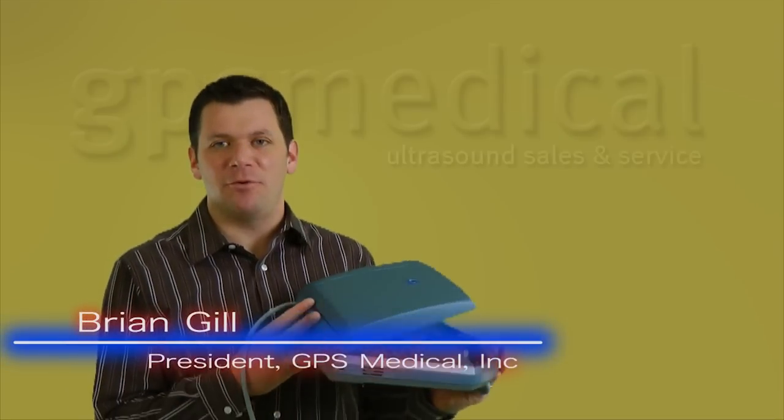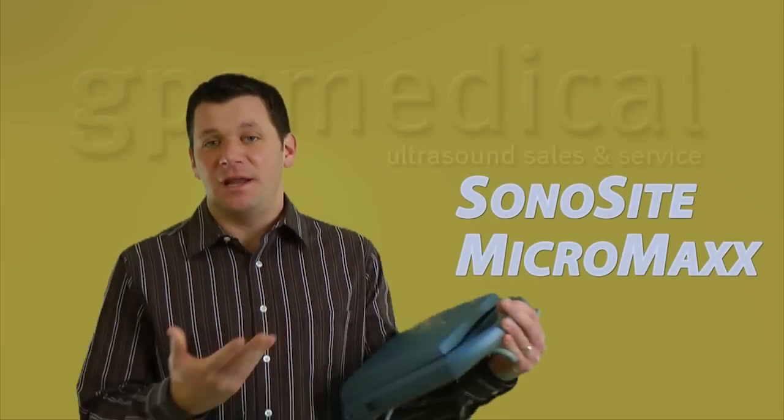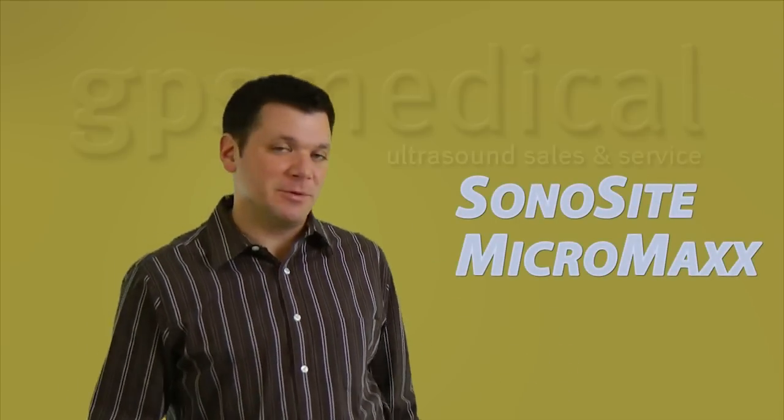I'm Brian Gill from GPS Medical, and today we're going to talk about the Sonosite Micromax Ultrasound. It is small, it's portable, it's durable, and it does a darn good job imaging too. Its price is good, and it's been around for probably 5 or 6 years now, depending on when you're watching this.